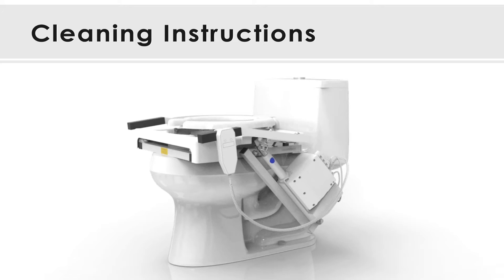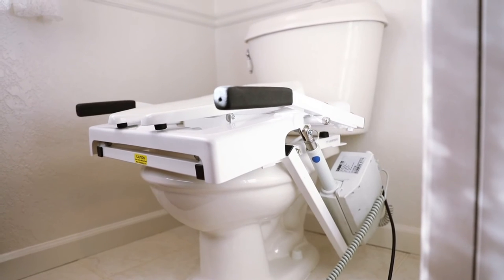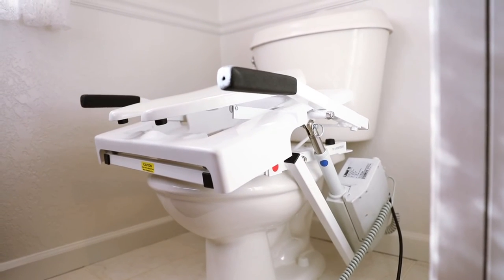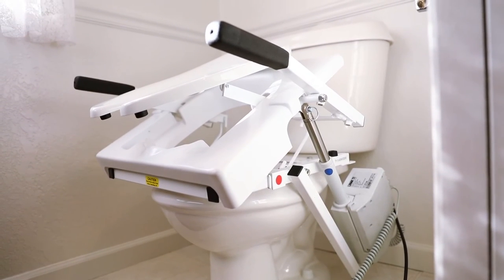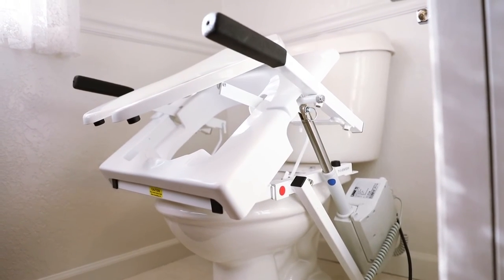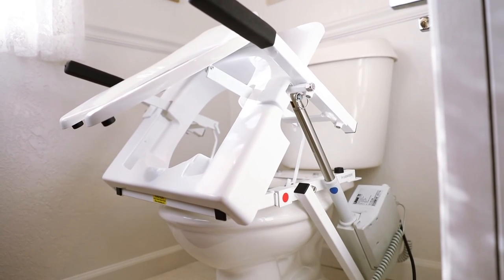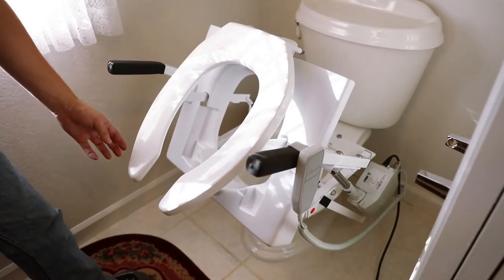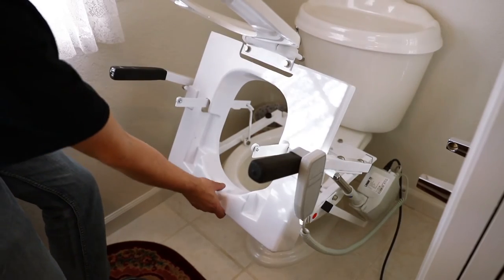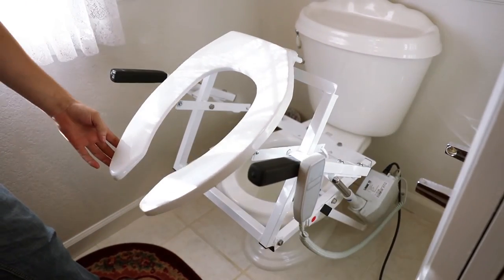For cleaning instructions, you can follow a few simple steps. Using the push button control, raise the tilt into its up position. Lift the toilet seat up and grab the front of the shield. Pull upward, then forward until the shield slides off of its frame.